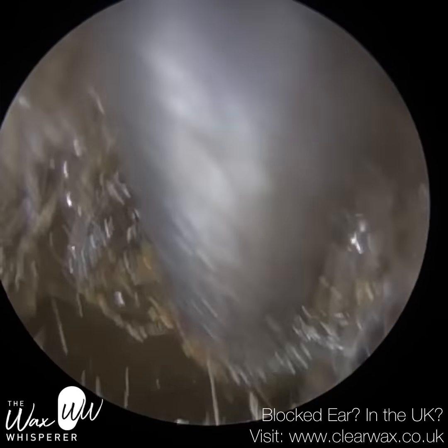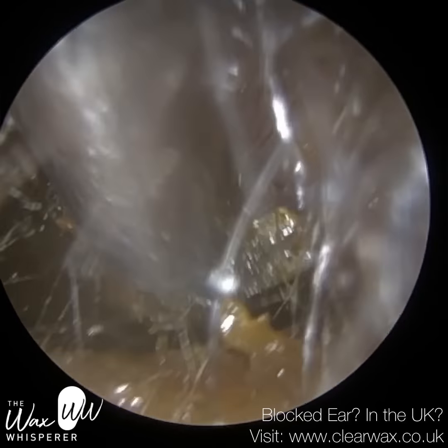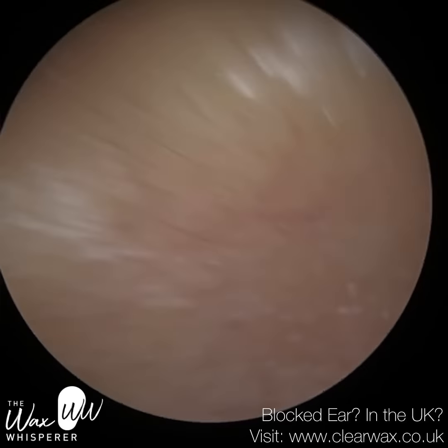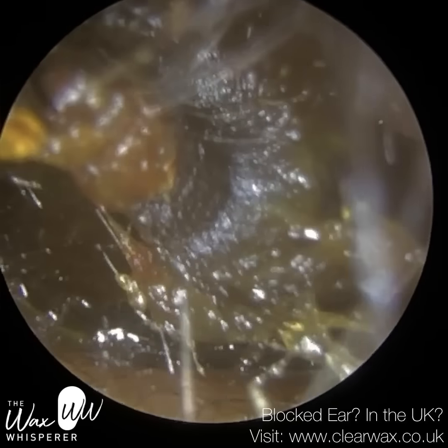You can compare it to an apple or an avocado if you like — if you slice into it and it gets exposed to oxygen, it oxidizes and it turns black.